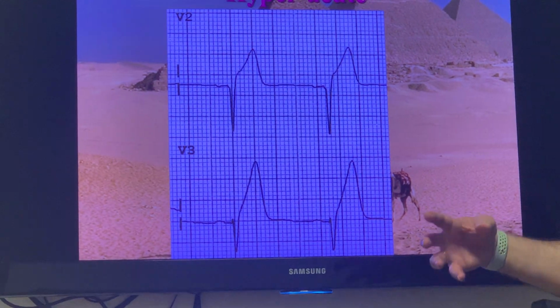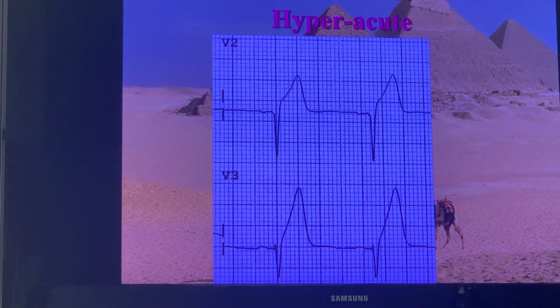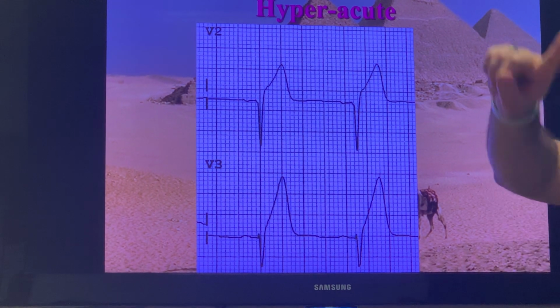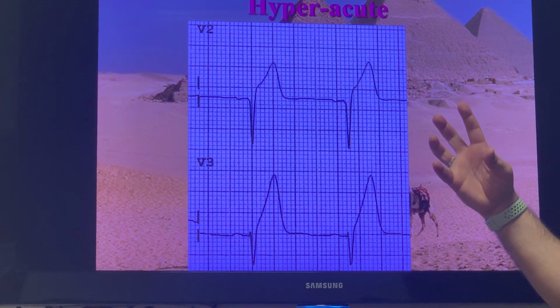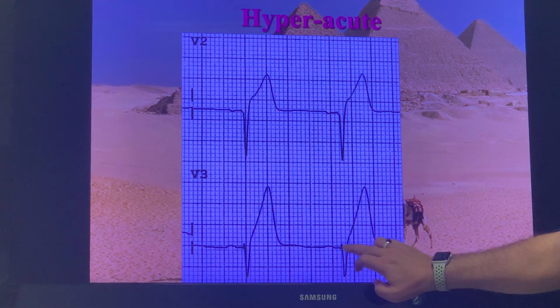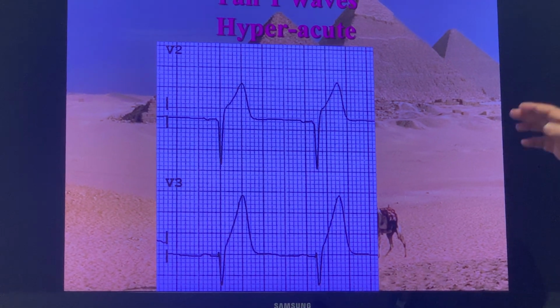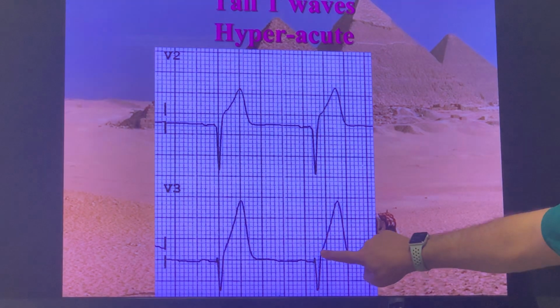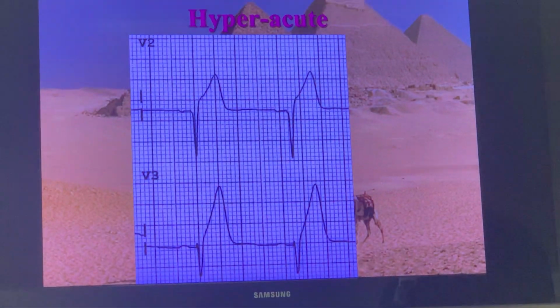If this patient repeats the ECG after a few minutes, you will find classic ST segment elevation. That's why when we see the ST segment elevation of MI, we find the convex elevation of the ST with distortion of the T wave, because the T wave has fused with the ST segment at this stage, and the elevation will come this way, and you cannot find the T wave anymore. You cannot define where the T wave starts and ends in MI. So it starts with this shape, and then coving starts to happen, and the elevation will be very clear.